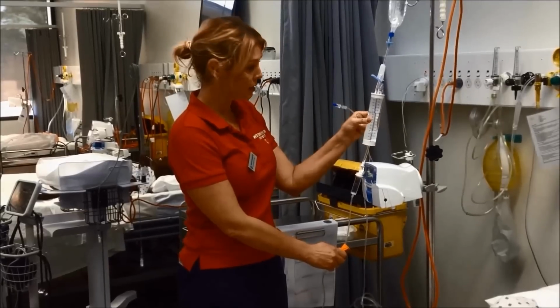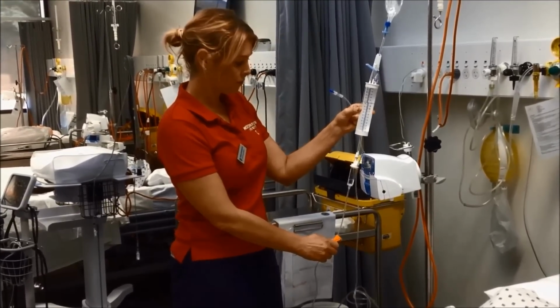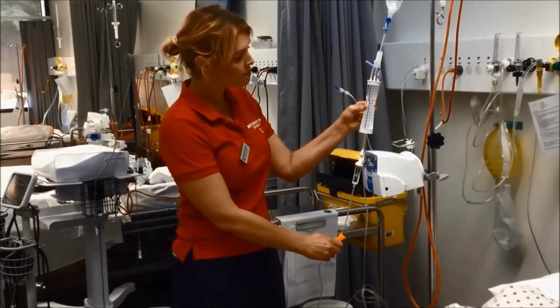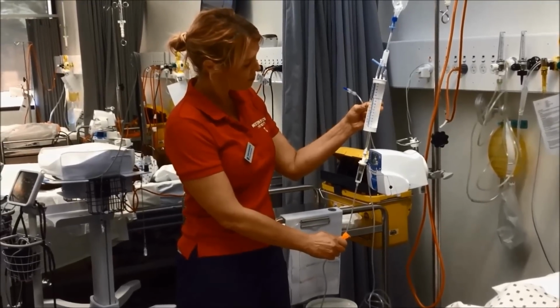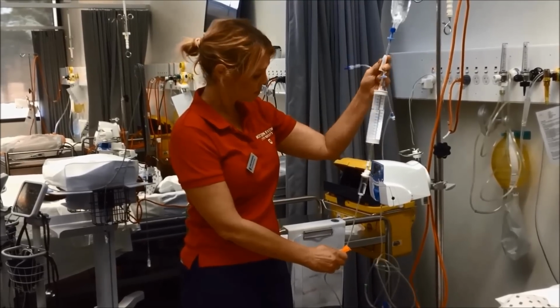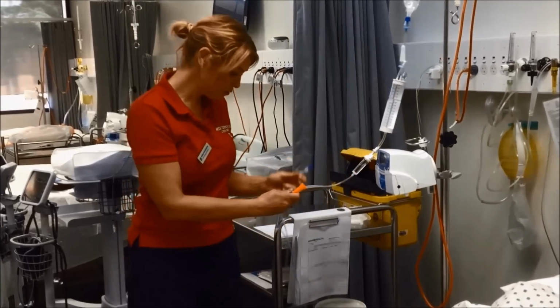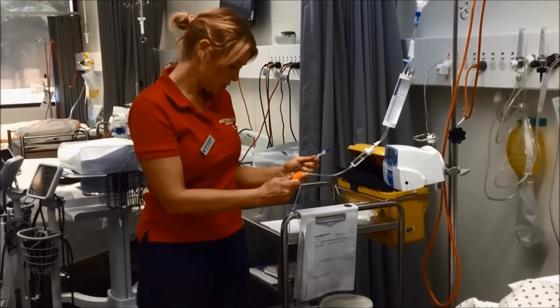If I want it to go quicker, I can squeeze it. And I'm going to prime my line. My chamber's half full.